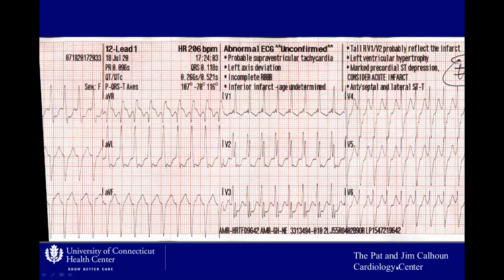All I can make out is the left rabbit ear is larger than the right rabbit ear. So right is bigger than the left. Sorry, yeah. That goes with VT, but we'll see. So the first question I have for you guys, is it wide or is it narrow? It's wide. It's wide. Okay. It's 120 milliseconds in V3. It's whitish. That you would see in a typical VT.